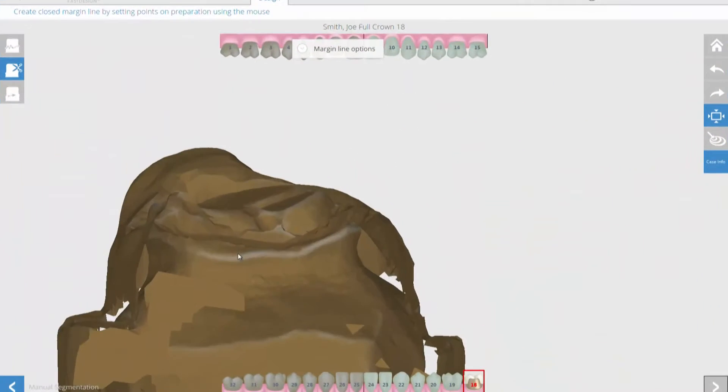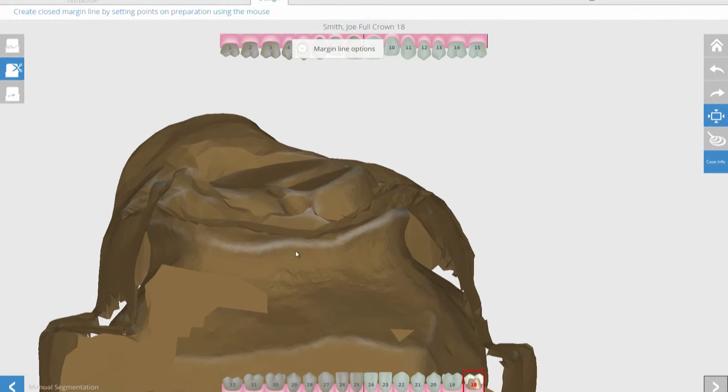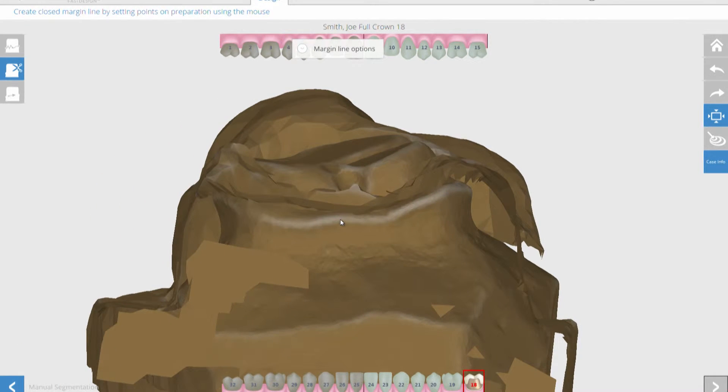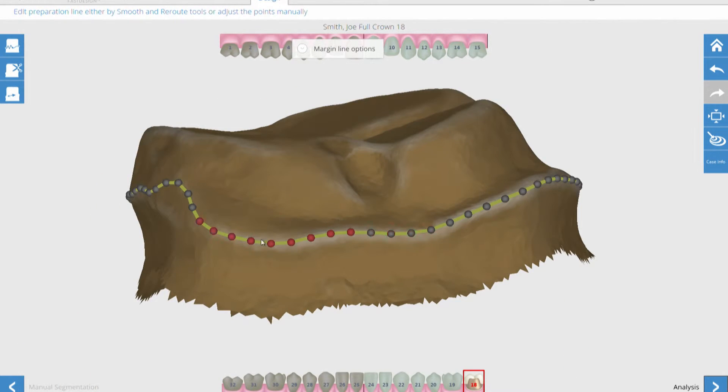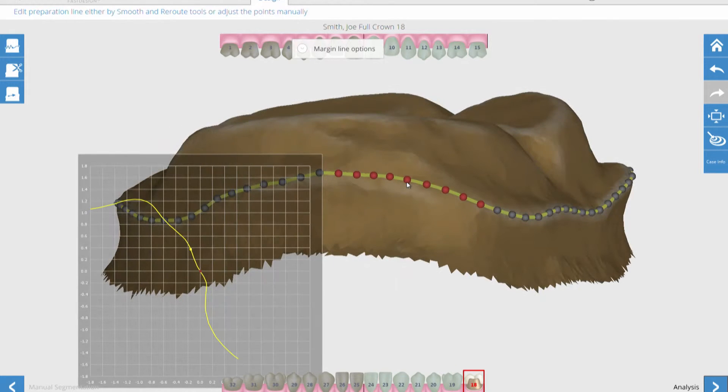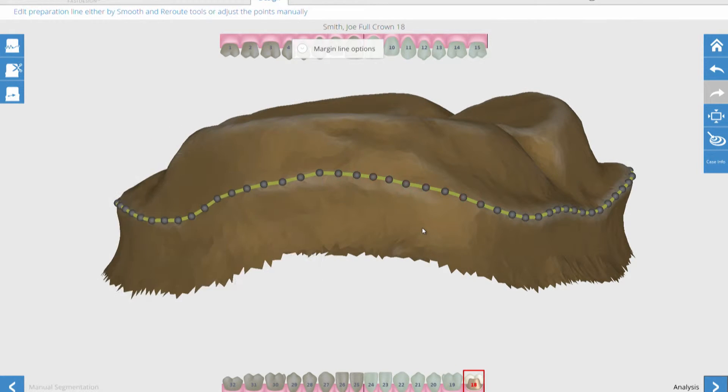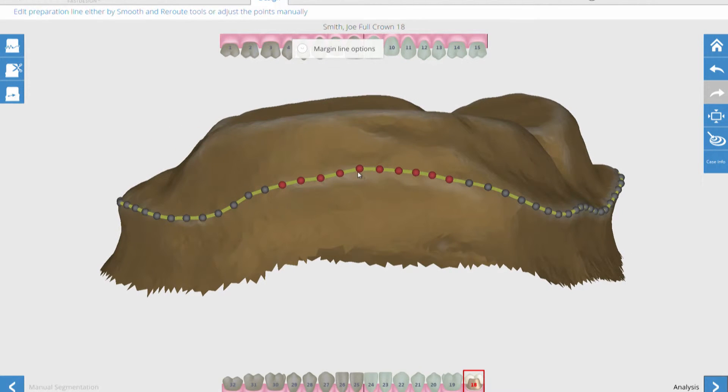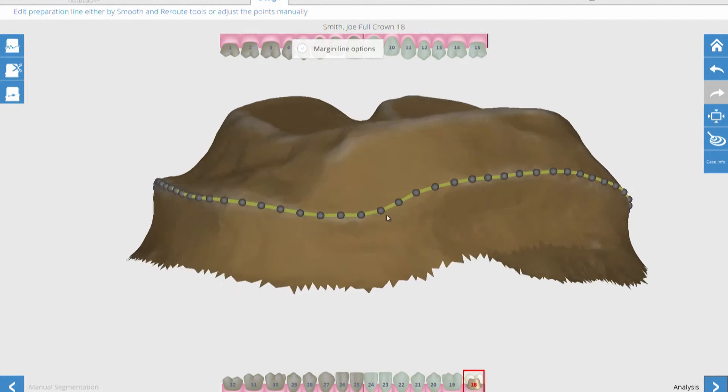Now we start the design process by identifying the margins. Fast Design features one-click margin identification. You have the ability to adjust the margin as desired.